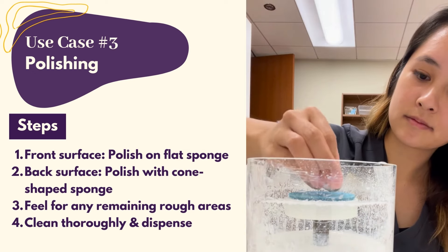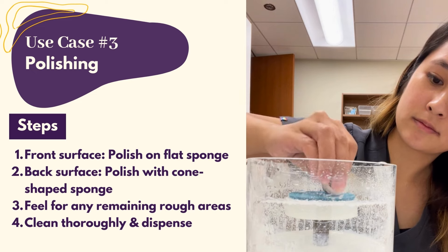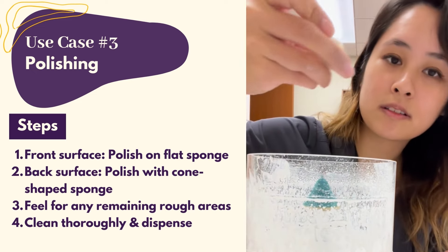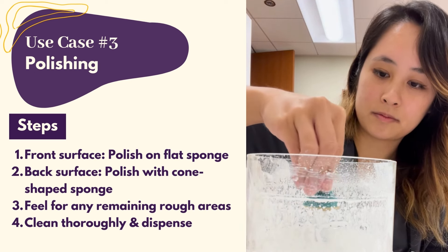Feel for any remaining rough areas and repeat. Notice how much smoother the front surface has gotten after polishing. Thoroughly clean with multi-purpose gas-permeable lens solution before dispensing.